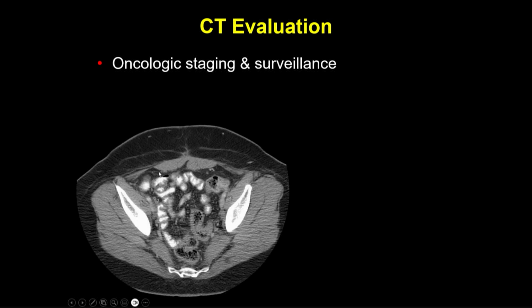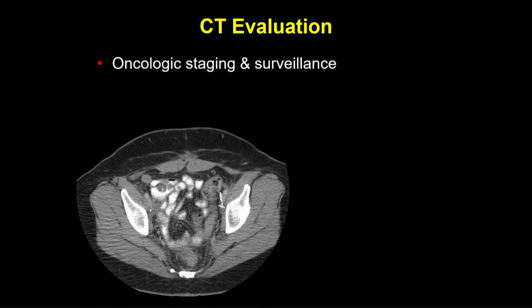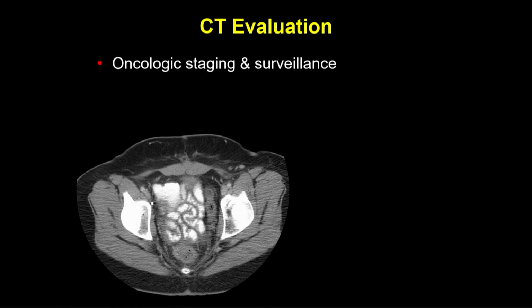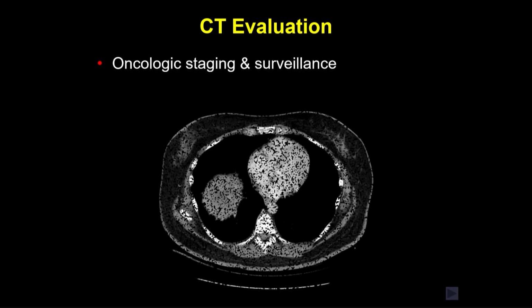So I know the people at Mallinckrodt are like, oh, we don't use oral contrast. But we do, and we love it. And especially for oncologic imaging, I think you're going to miss things without it, no matter how good you are. And we were able to do an ultrasound-guided biopsy of that lesion to prove early disease.